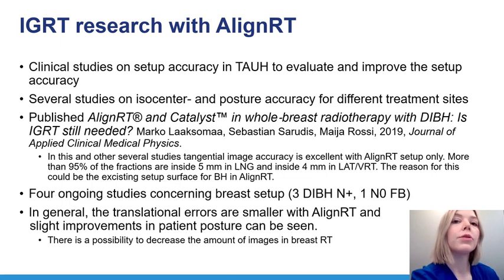From the beginning of 2017, when the AlignRT was first installed here at our hospital, we've done several clinical studies to improve our DIBH workflow. The goal has been to improve the patient setup accuracy, but at the same time to evaluate the possibilities to make the setup workflow more practical and the treatment itself less time consuming.